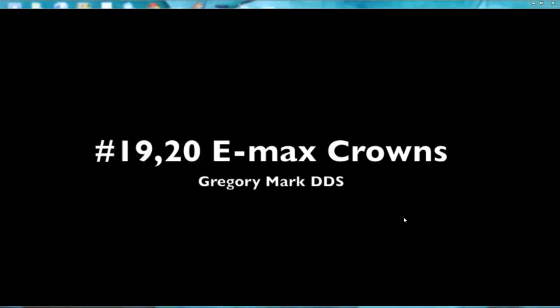Hi, today in video part 1 we're going to discuss a clinical case of E.max crowns number 19, number 20, how to approach the case, what my management is in this case, and in the second part we're going to discuss how I used Omnicam to deliver this case.